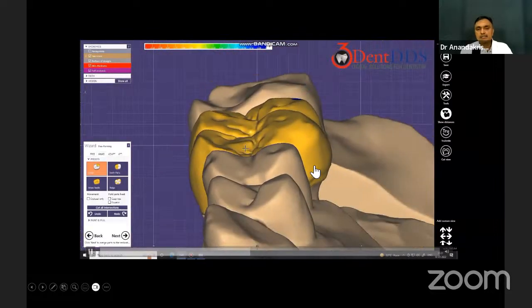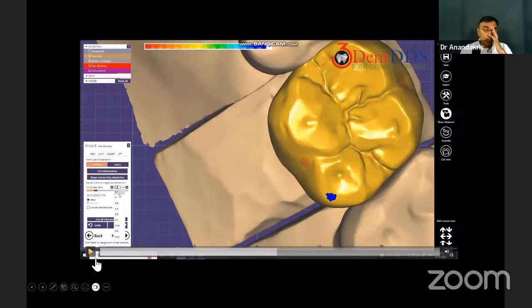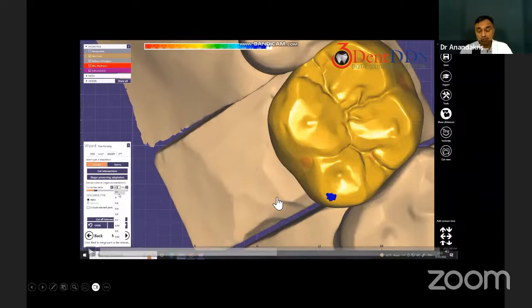And then he's just modifying a bit. See, for example, if you had to carve this particular molar, it would take almost about half an hour for us. As prosthodontists, we all went through this rigorous training of anatomy, and we went through the wax-ups. So when you do wax-ups like this, it would take almost about half an hour, and our professor, Dr. Solomon or Dr. Sridhar Shetty or Dr. Chetan Hegde would say, oh, you know what, this is not even up to the mark. So all your half an hour's work would go waste and you would start doing it again. But today, the software does most of the work, and you cannot go wrong with the software. It will analyze the occlusion, it will analyze the occlusal surfaces of the adjacent teeth and the opposing teeth.